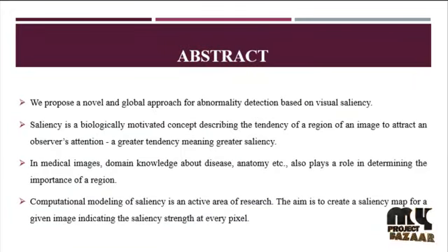Now we are going to discuss the abstract of our project. The segmentation of a skin lesion in dermoscopic images is a fundamental step in the computer-aided diagnosis, CAD, of melanoma. Conventional segmentation methods, however, have difficulty when the lesion's border is uncertain and when the contrast between the lesion and the surrounding skin is low.